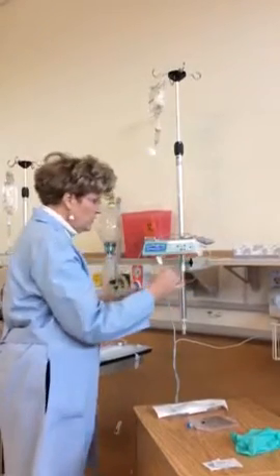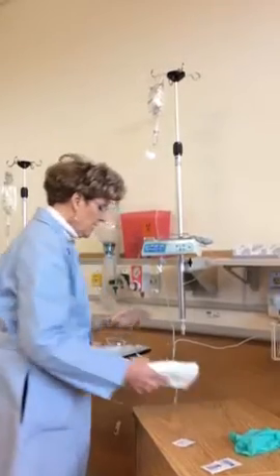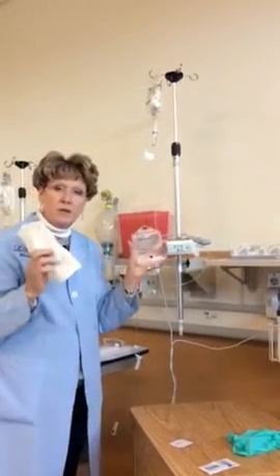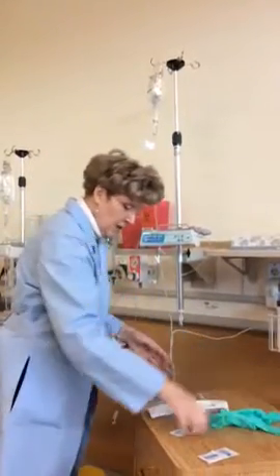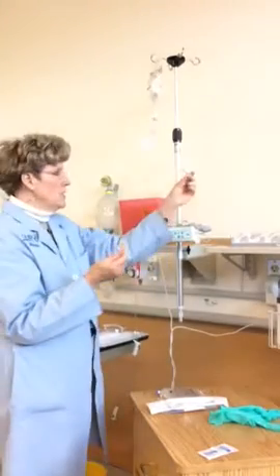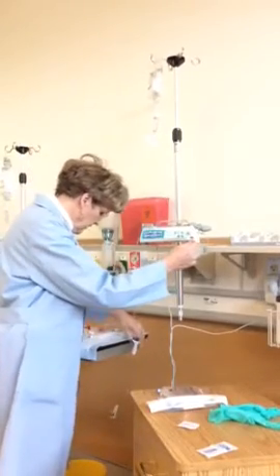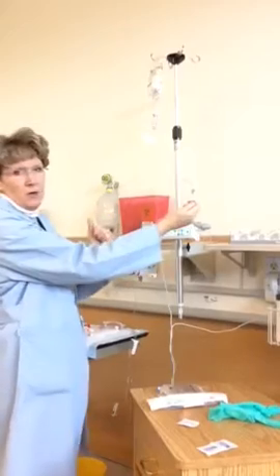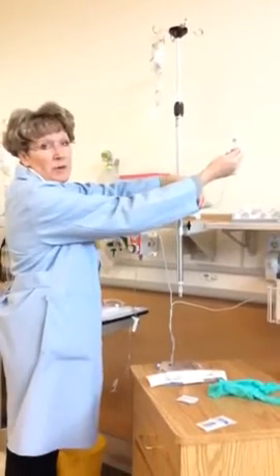Now I'm going to get ready to attach my IV piggyback. I have a 50 milliliter IV piggyback. I'm going to need brand new secondary tubing. I will need gloves again, as well as an alcohol swab, because I'm needing to attach this piggyback. One thing that I didn't mention in our other films is that you need to know which port I'm going after here. This port is between the bag and the pump.